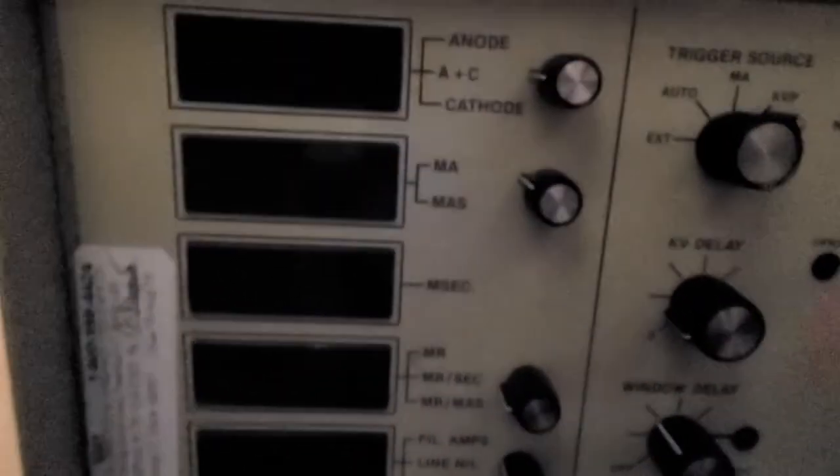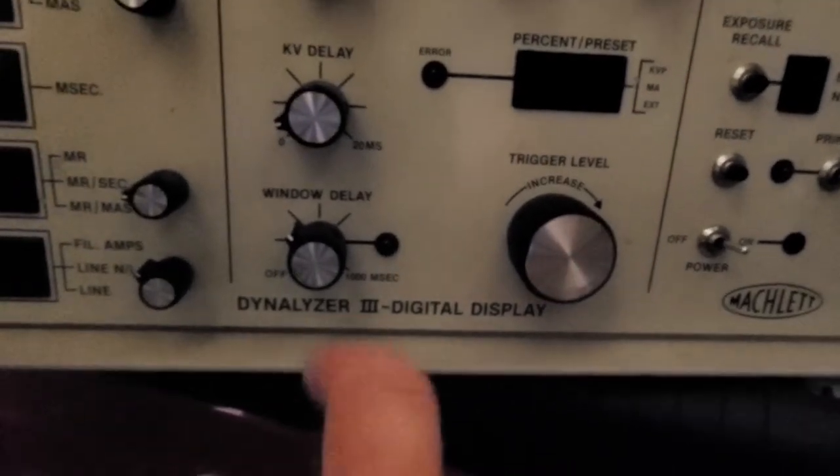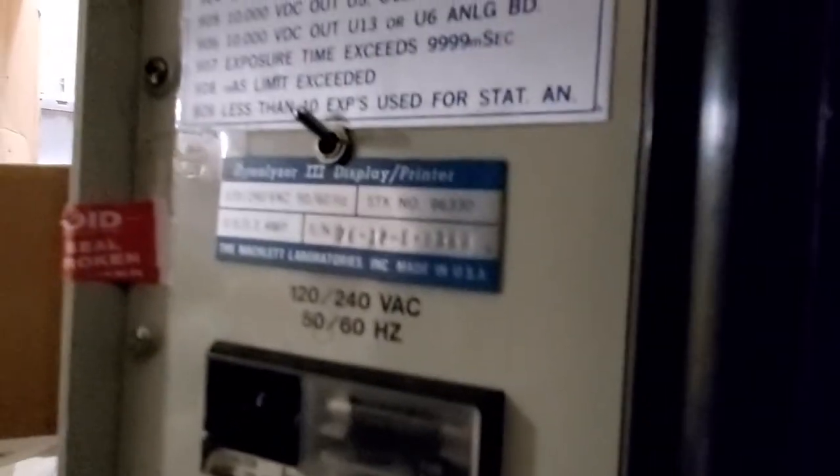Anyway guys, I guarantee all these segmented displays are gonna work perfectly fine. If you want to do some research, look it up — Dynalyzer 3. The serial number is 76-12-6-0383.